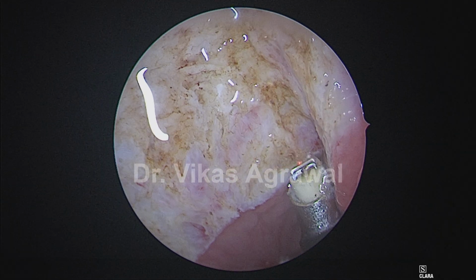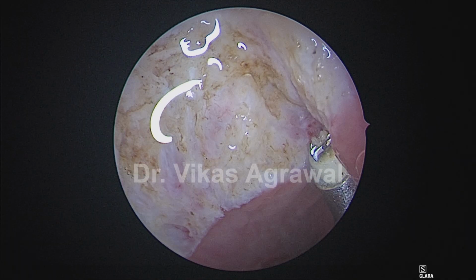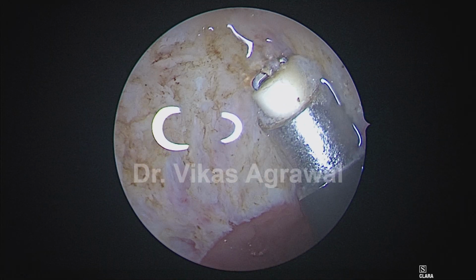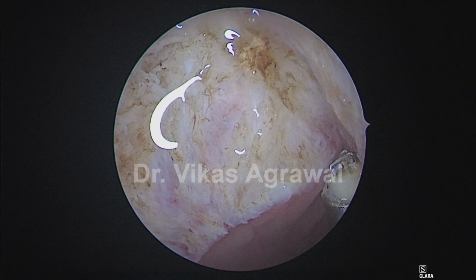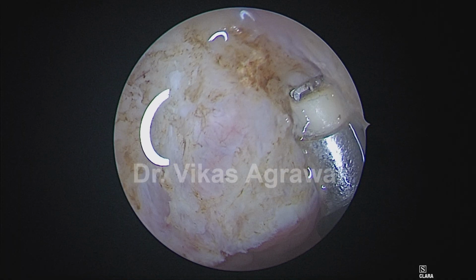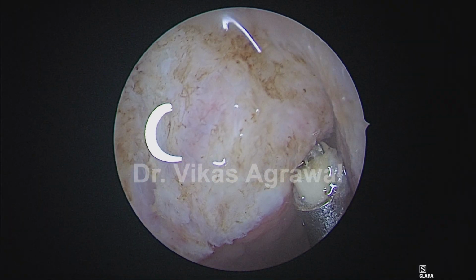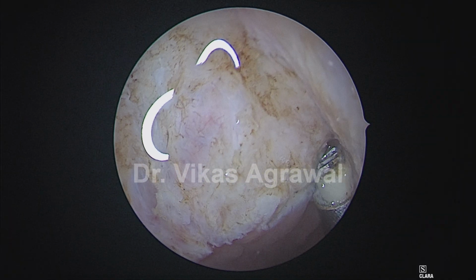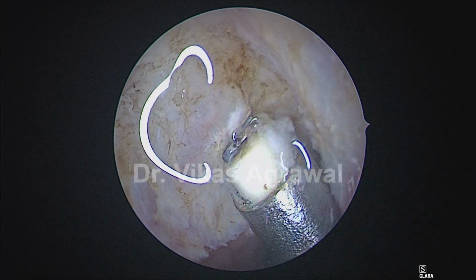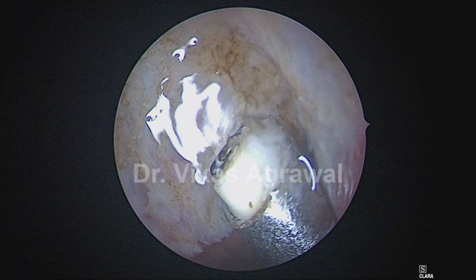Directing the wand medially, I can go inside and remove all the tissues. Now, if you're not very confident, you can coagulate it. So you can go inside and you can coagulate these tissues. If you're not very sure, do not try to ablate, coagulate it. All right. So you can always coagulate this bit of tissue, cushion of tissue, which is behind the torus tuberous. Here, since I can see very clearly, I am ablating now.